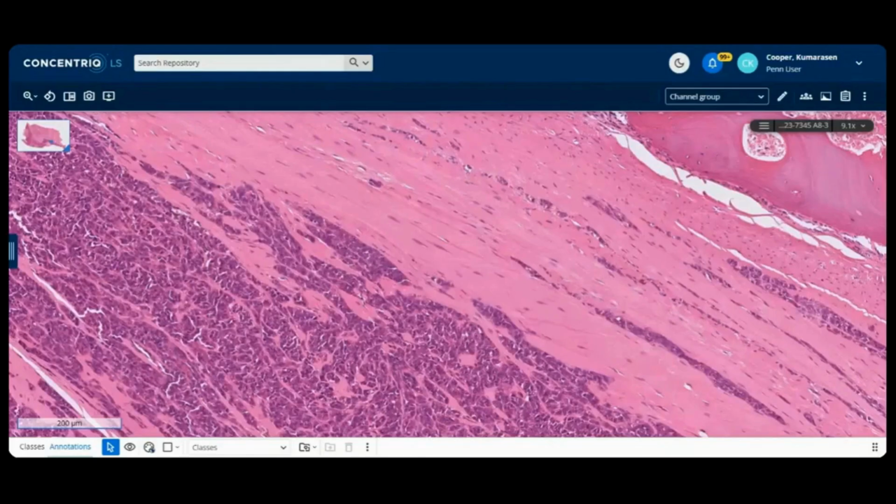You know, you never discard melanoma in any context. When I'm looking at biopsies, particularly soft tissue biopsies or bone biopsies, I'm always throwing in my melanoma markers. My screening markers are typically S100 and SOX10, because of its role in nerve sheath tumors as well. But those are always in my differential diagnosis. So I like that, Heba.